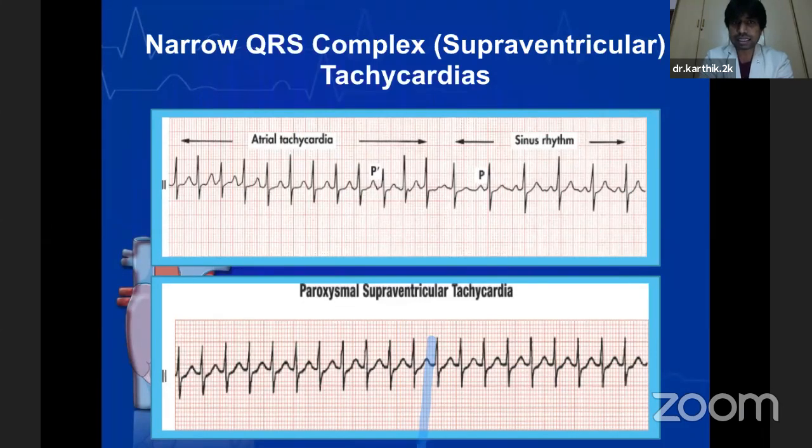Now this is an example of atrial tachycardia. You can see that in the first illustration, there is a narrow QRS complex tachycardia. There is a P wave, which is followed by a QRS complex, and suddenly the tachycardia terminates and it reverts back to the sinus rhythm. You can see the duration of RR interval has gradually normalized. In the bottom illustration, we can see another illustration of a paroxysmal supraventricular tachycardia, where there is extreme tachycardia. The heart rate is close to 190 to 200, and the tachycardia has narrow QRS complex.